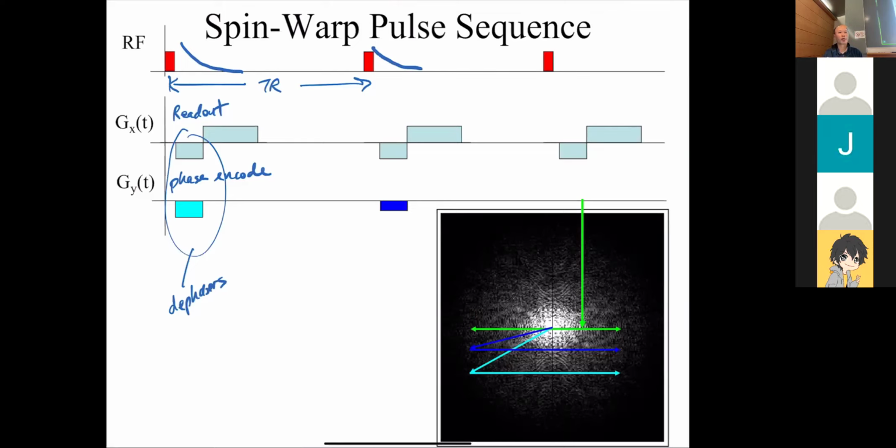It's like you have an ice cream, you lick it, you go, yum, yum, yum. And then at some point you wait for your taste buds to recover, and then you can lick it again. Or think of a toilet: if you flush it, and then try to flush it again, nothing's going to happen. You got to wait about 30 seconds for it to fill up, and then you can flush it again. So that's the same thing.